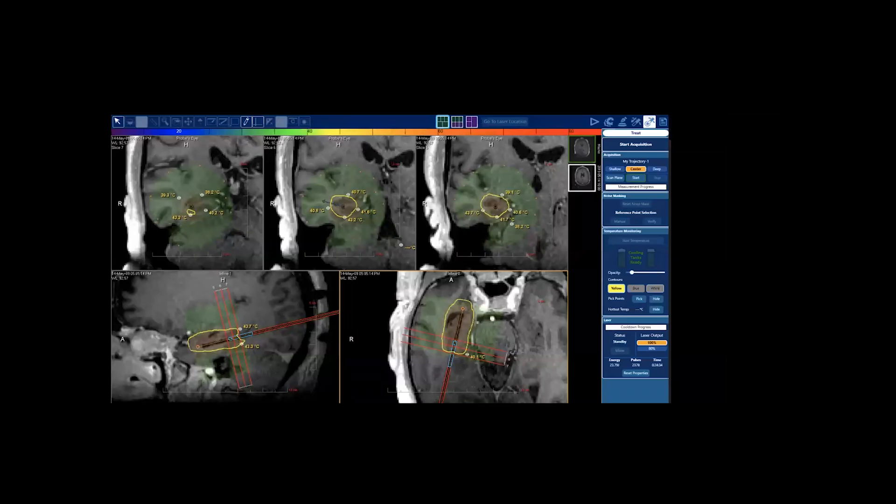An MTLE case which can show you the orientation of the fiber, the approach which is a posterior occipital approach coming down the long axis of the mesial structures. You can see in this case, what kind of thermal map is that, is that reversible or irreversible? It's yellow, it's reversible. Wow, beautiful. So you can see where the ablation is happening there.